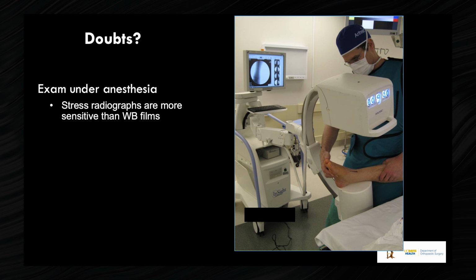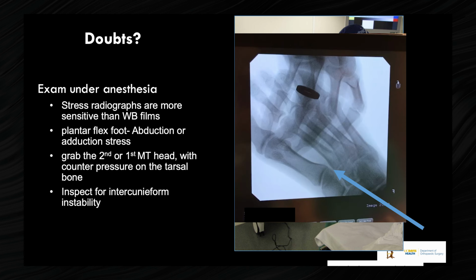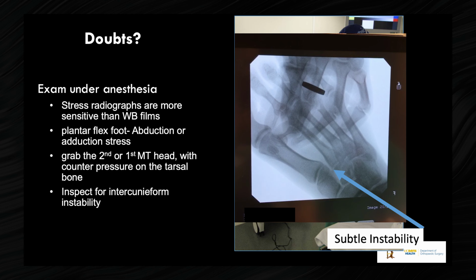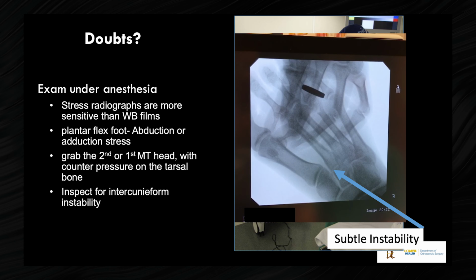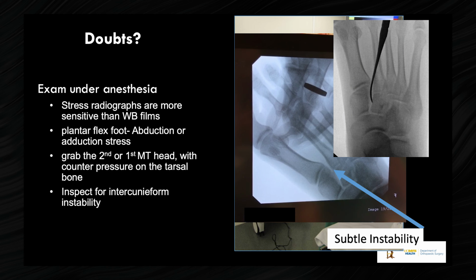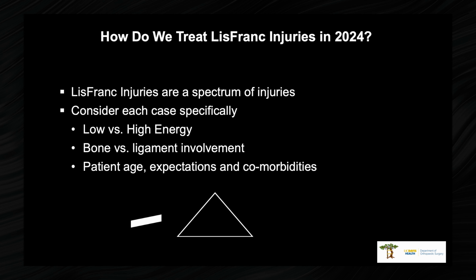And usually I'd like to take it to the operating room and just double check. In a stress radiograph, and this was one from Chris Krul, showing this subtle instability. And so that's often missed. And then this gives you the opportunity to see if there's any intercuneiform instability. So it's a spectrum, okay?